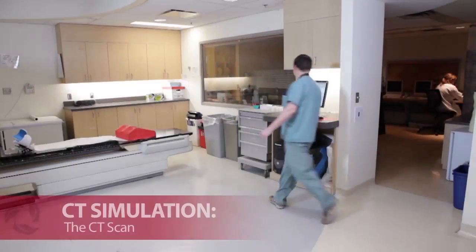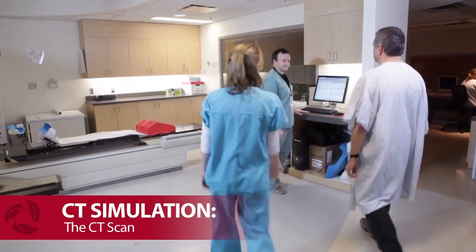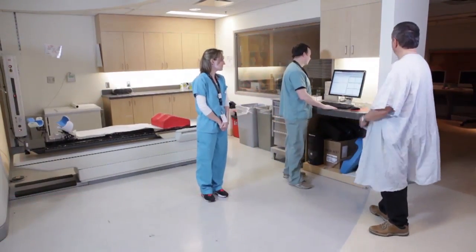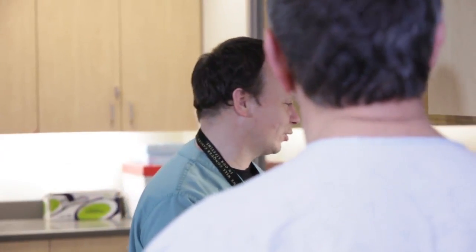I found the whole appointment process actually very accommodating. The CT simulation is used to gather information about your body shape, the location of the cancer, and your healthy organs. That CT scan will be used to plan your treatment with your radiation oncologist. Most patients who come in for their CT simulation have concerns and questions and they're afraid because it's the first step of the process.